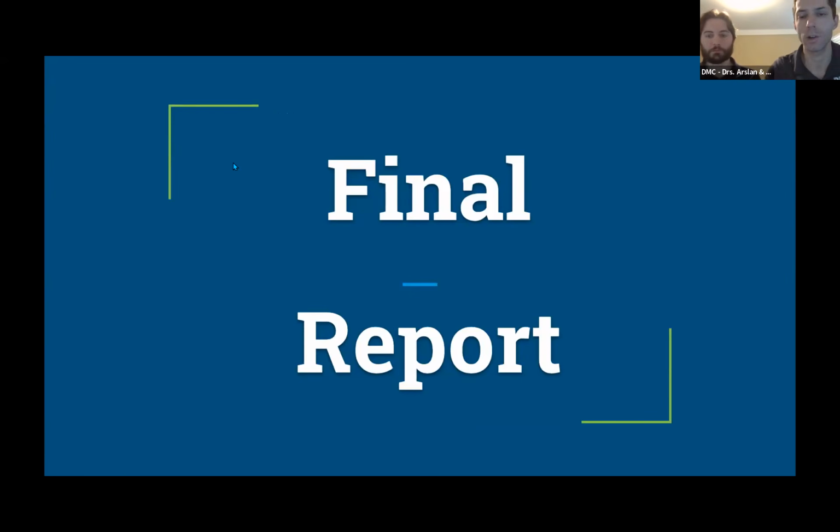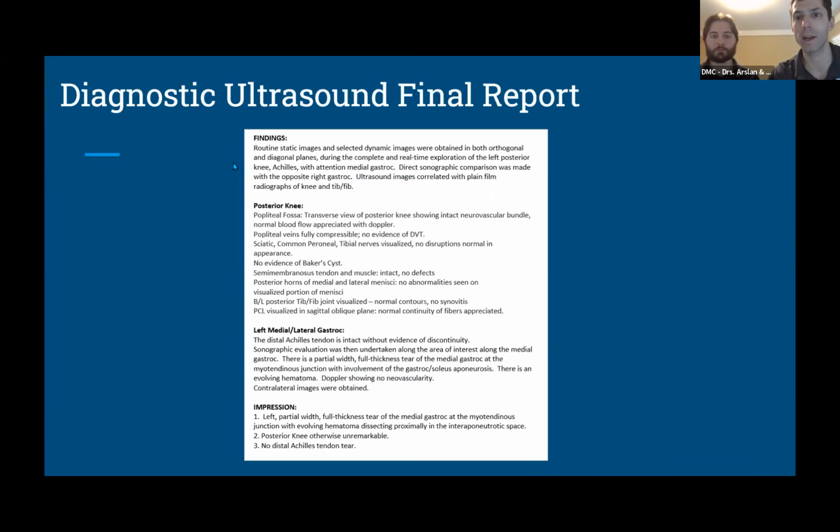Great. So that concludes our ultrasound scan. So now for the final report. The body of this was read to all of us as we went through the images. So for the sake of time, we felt that we'll just share the impression with everyone.